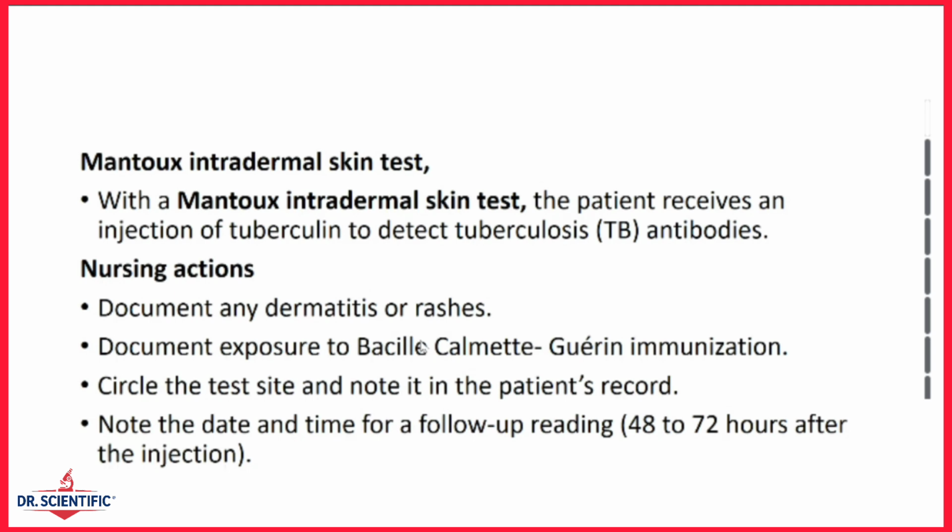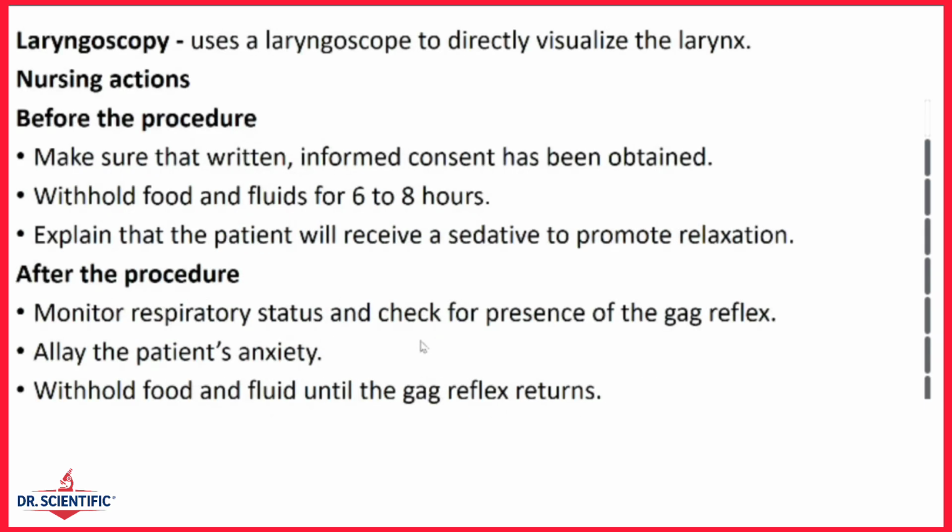Then laryngoscopy. Again, oscopy means visualization. In this case, now we are visualizing the larynx. So again, before the procedure, informed consent, withholding meals, explaining the procedure to the patient.